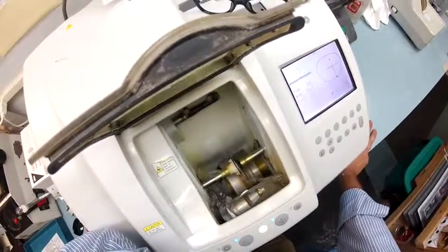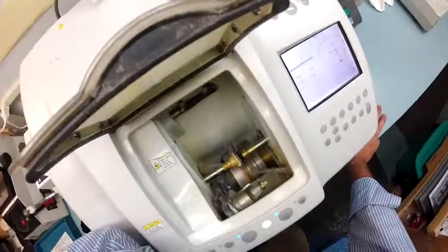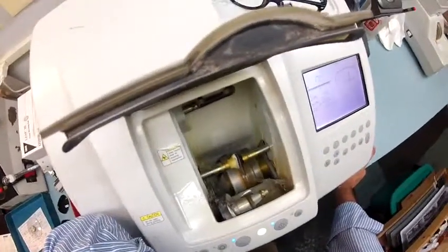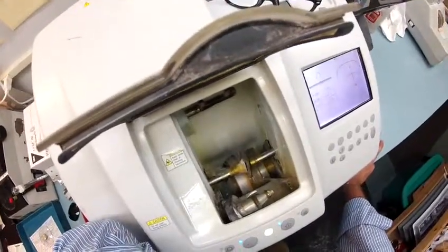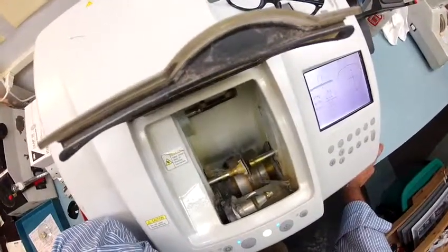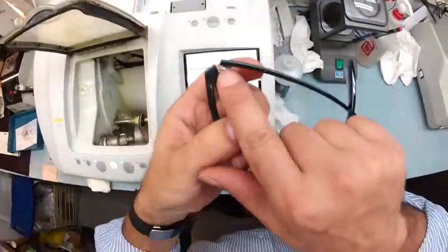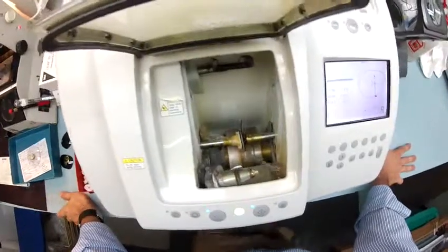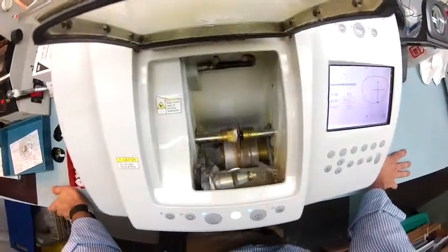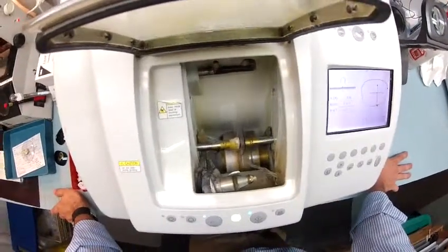As a plus 1.75 reader, that puts you in the mid to late 40s. I know because I'm 47 and I wear a 1.75 also. I need some distance correction in the top, but I need a 1.75 in the bottom so I can tighten those screws in the frame — when I need to see a black screw in a black frame, I couldn't do it without my 1.75s. And that's in addition to my distance prescription, which I need now.